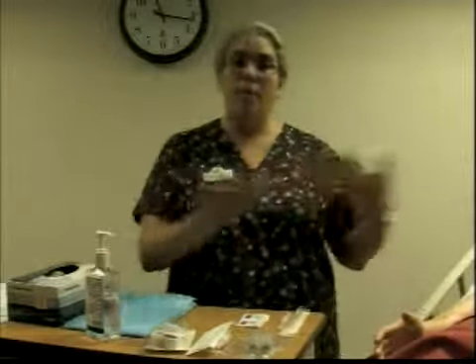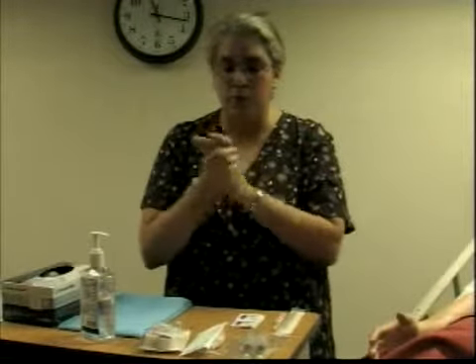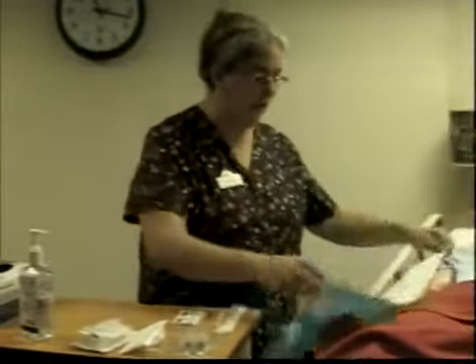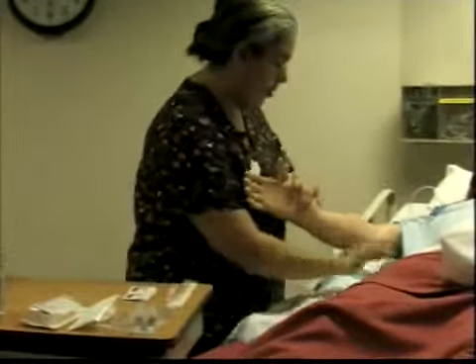Okay? So when you come into your patient's room, you identify yourself, you identify your client, you explain the procedure to them, and then you proceed to wash your hands. Then you gather and put your supplies together in such a way that when you are ready to do the venipuncture, you have everything accessible to you. The first thing that I do is put a chux underneath the extremity where I think I'm going to perform the venipuncture.